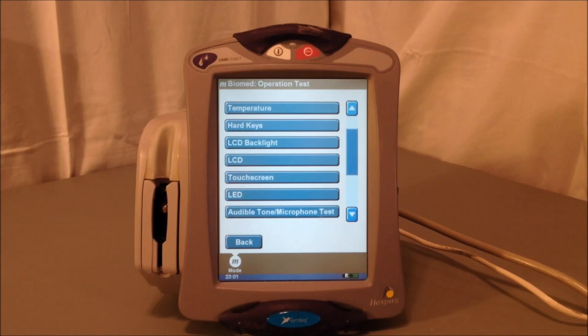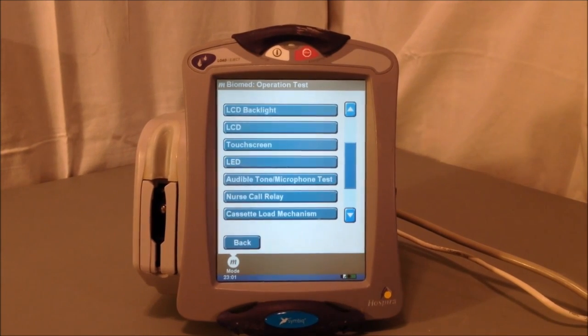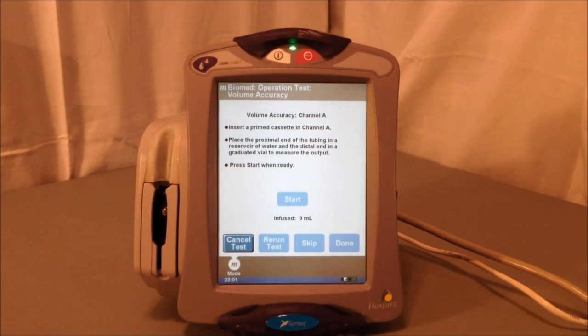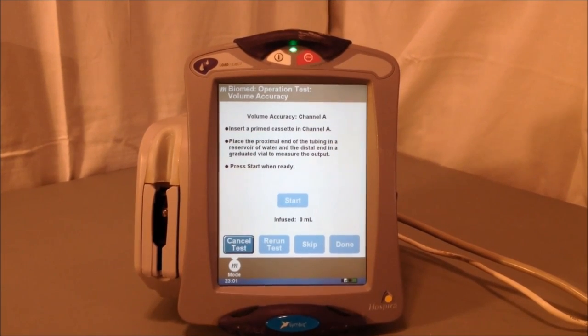Once we drive the user interface, we're driving it into what's called a biomed mode, which is a kind of service menu mode. And then we initiate some functionality that's not supposed to be initiated, right? That leads us to another set of issues that we deal with in the medical world as well, and that's called intended use. But we'll get to that towards the end.